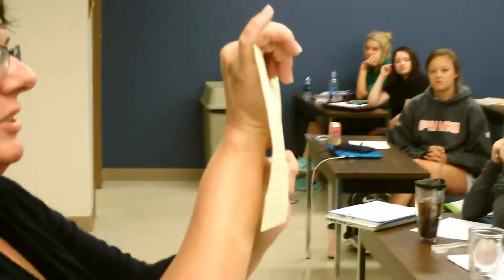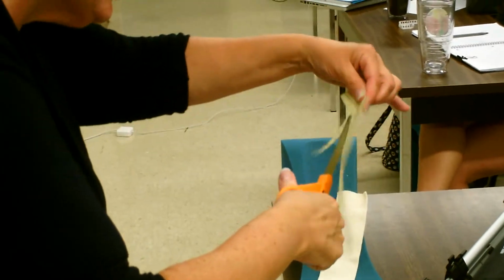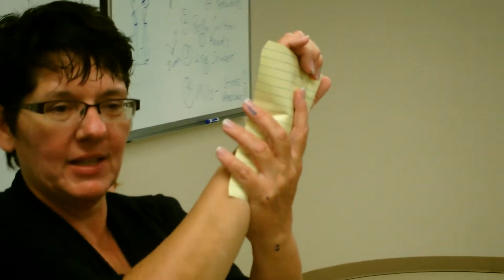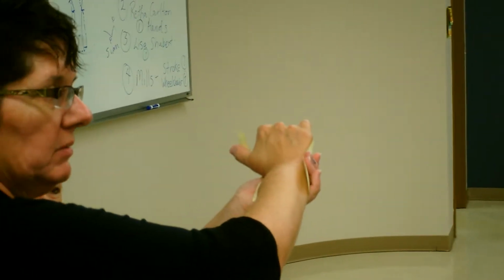So, I always kind of try it on the patient, and I'm like, oh, I could tell this looks too wide here right away. So I probably need to trim it in a little bit here. Just sort of curve it in. You see that? It kind of should look like that. See it? Are we good, friends? So look, it's going to wrap like this. Is everybody good with that? This is how the splint's going to be.